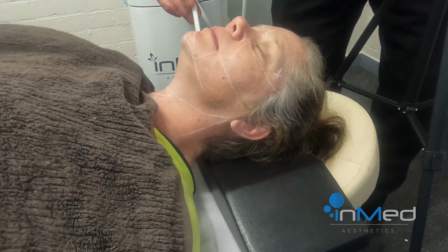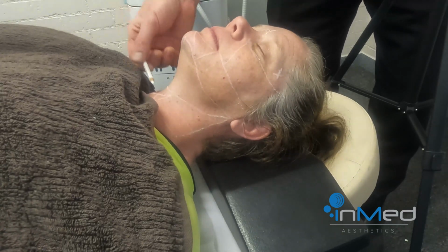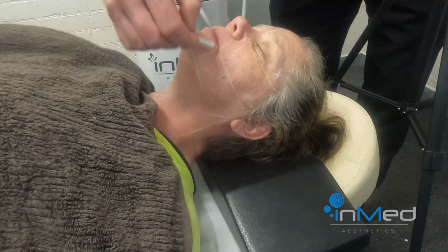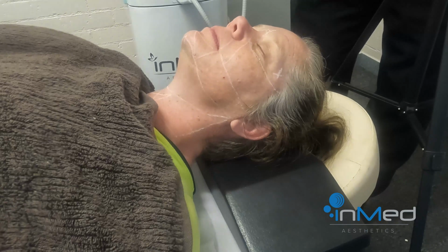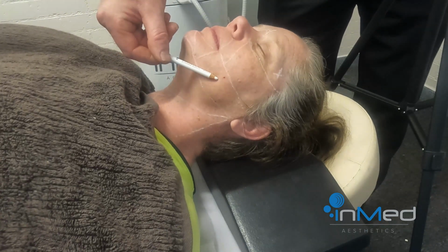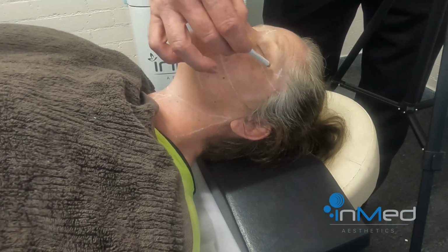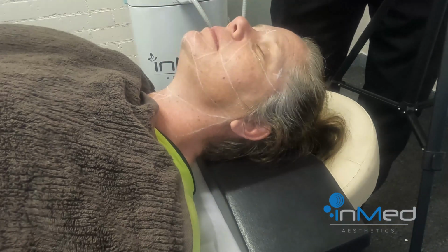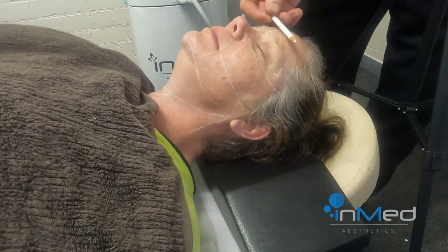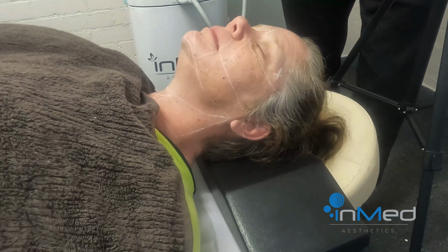Through the chin area here is also 1.5 millimeters only. So 1.5 millimeters from the top of the side of the nose to the top of the mouth, 1.5 millimeters across that section too. So neck, chin, jaw, cheek, nasolabial area, under eye, and then from the side of the eye itself up behind, in front of the temple, we then have the side of eye and then the forehead region. So what we have now is a complete markup of the entire face, ready for treatment.